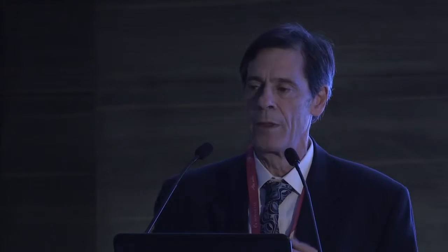Well, why is it important to try and quantify these defects? It's because, as I've mentioned, the structure correlates with the function. So the first part of this approach was to create an en face OCT reconstruction. So the idea, rather than manually outlining each of the layers, was to use a semi-automatic ellipsoid zone loss area segmentation, and then to correct it.